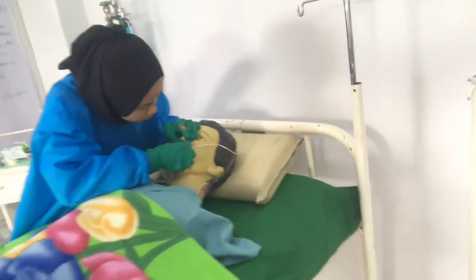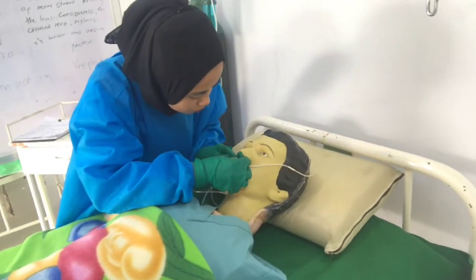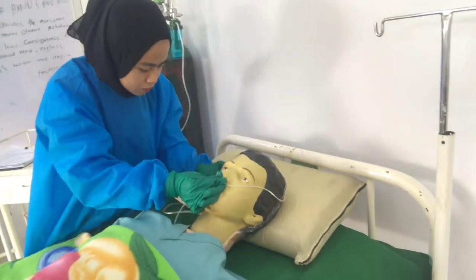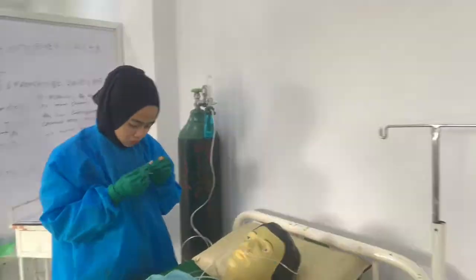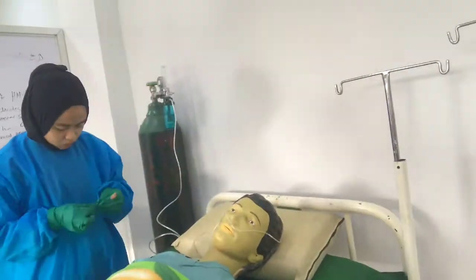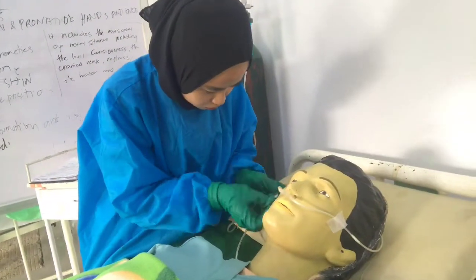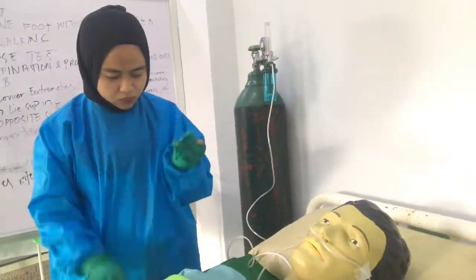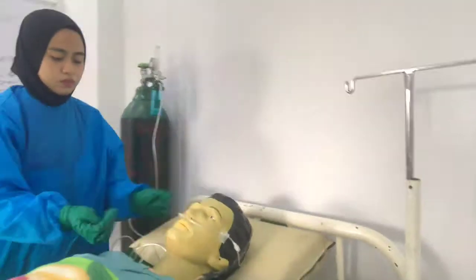Gently position nasal prongs into client's nares with curves of prongs pointing toward the floor of the nostrils. This is to apply nasal cannula and secure its position. If the cannula will not stay in place, tape it at the sides of the face. This is for the cannula to stay in place. Assess the nares, face, and ears every 4 hours for signs of skin irritation and breakdown. This is to maintain skin integrity.